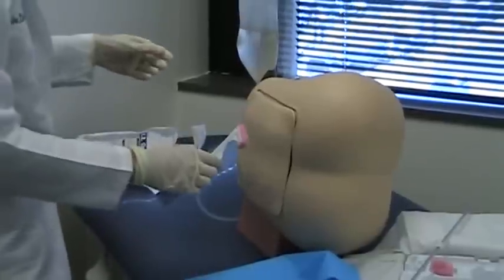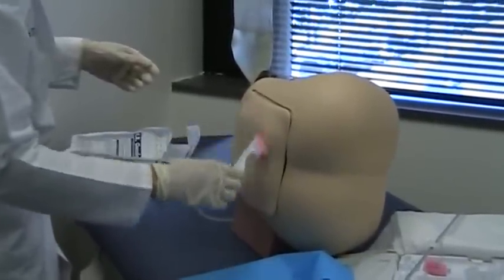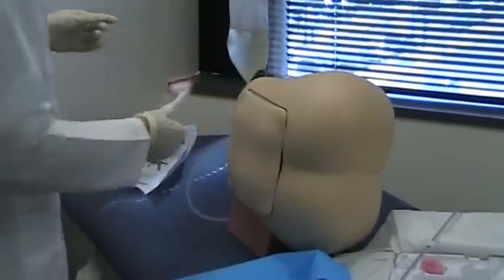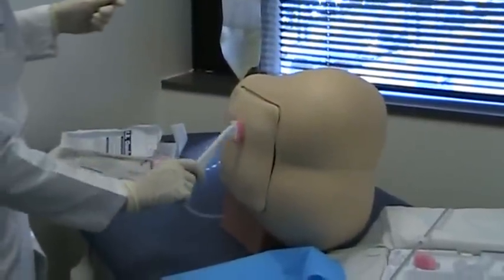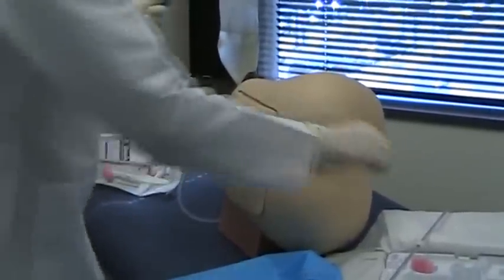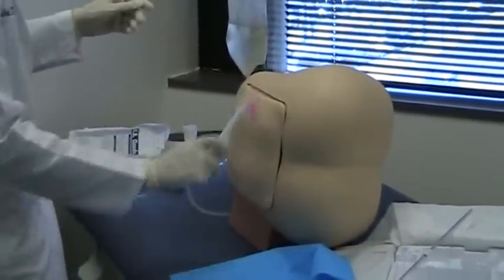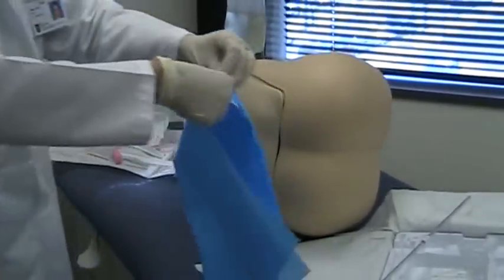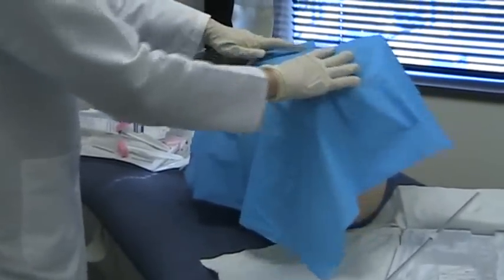To prep the skin, we start with circular movements beginning from the center going outward. We do not put the swab back in the tray — discard it. We repeat this three times to clean the skin.